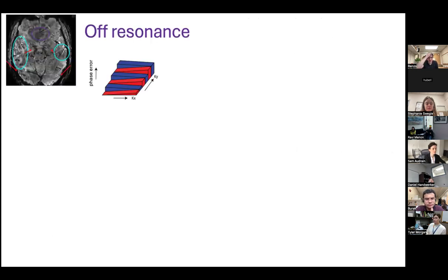Right. Last but not least, let's look at off-resonance effects, namely these interference patterns over there. They're not only annoying with respect to distortions, but specifically also with respect to artifacts. And here I'm showing you a cartoon of where I think the problem comes from. Here you're seeing the phase error as we go through k-space in EPI sampling. Basically, if we have an off resonance, we have a different phase, and that accumulates the more time you spend acquiring data.